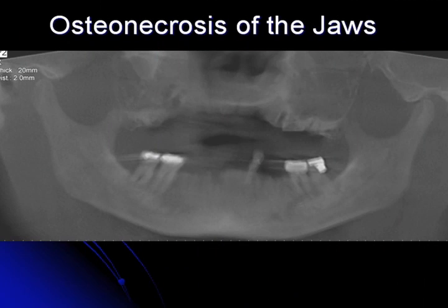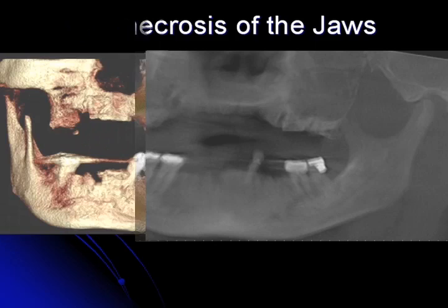In some cases, there may be direct contraindications to doing implant placement in some of these patients. So these scans can give us a good idea if there's pre-exposed bone, basically, meaning radiographic evidence of necrotic bone going on before there's actually sequestration or a large advanced lesion in the mouth. Or it can tell us the quality of the bone at an implant site, for example, in a patient that's been on bisphosphonates and will need implants at that site. So keep that in mind.